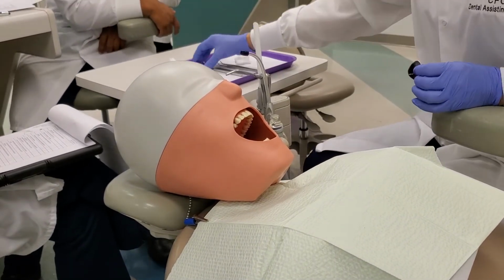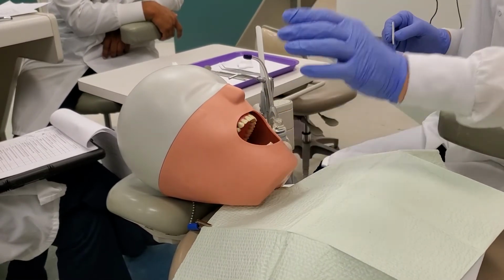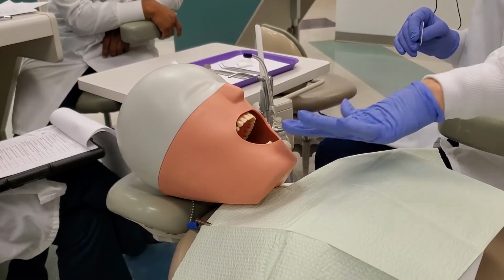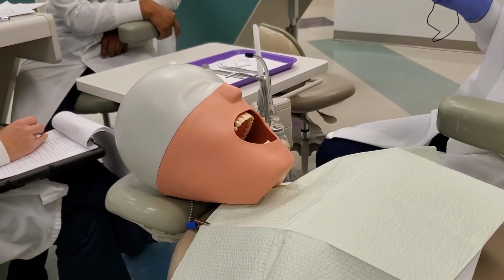Whenever you're taking anything cotton, any absorbent, out of the patient's mouth, you have to make sure that it's wet before you take it out. Because if it's dry and you try to take it out, you're going to tear the tissue. So the same thing with this.